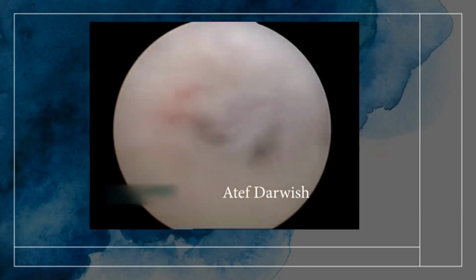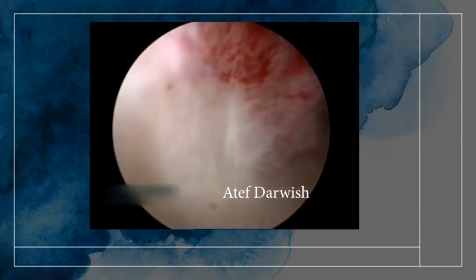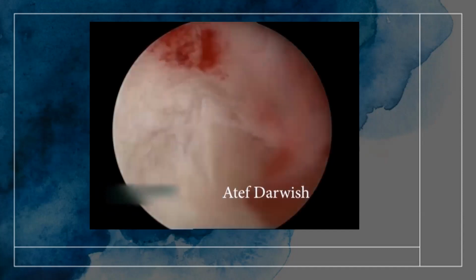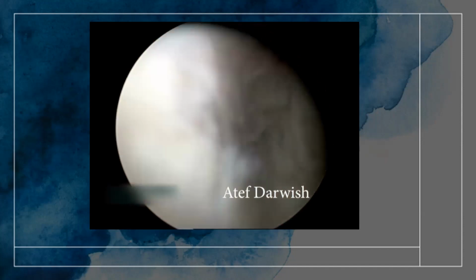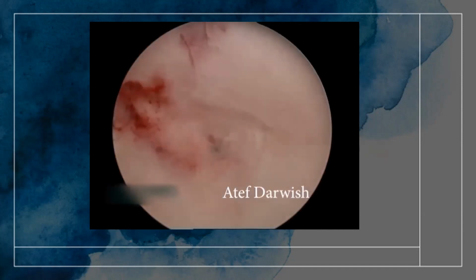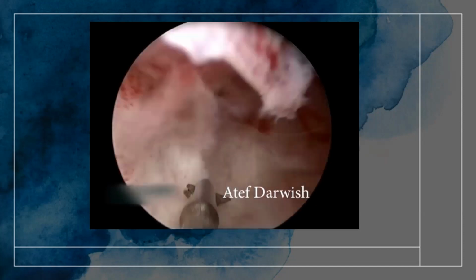When you go back with the telescope and try to see the right side of the patient, you will be confronted by adhesions occluding the upper part of the endometrial cavity and masking the Darwish Hysteroscopic Triad. So you cannot see the ostium, the intramural part of the fallopian tube, or the dark spot. Here you start to localize, or expect, the site of the right Darwish Hysteroscopic Triad by focusing on the left side and trying to move in a horizontal way. And this site is completely occluded by dense adhesions.